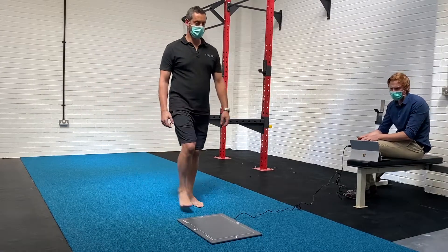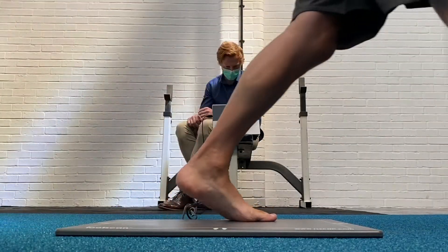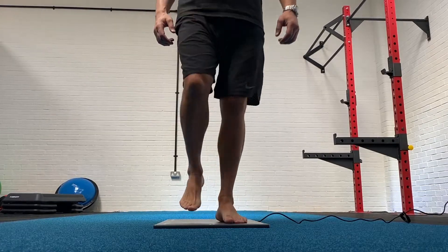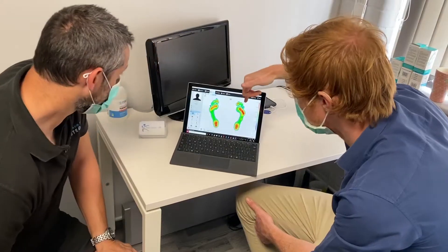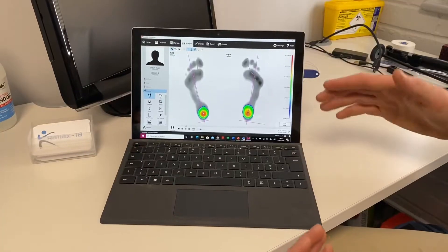With the RS Foot Scan, we can analyse your foot movement as you move over the pressure mat. As you place your foot on the mat, thousands of tiny pressure sensors detect the movement in your foot, giving us the data that we need to fully analyse your movement. This creates an objective measurement that no longer relies on the inaccuracies that can be seen from observing.